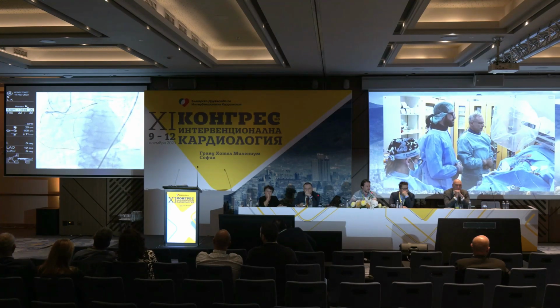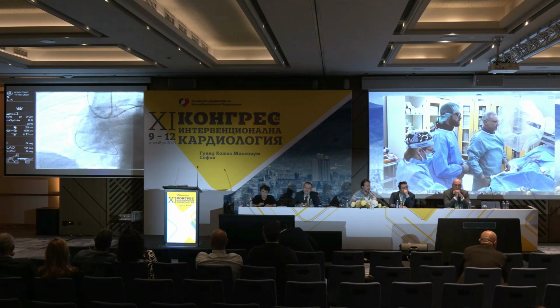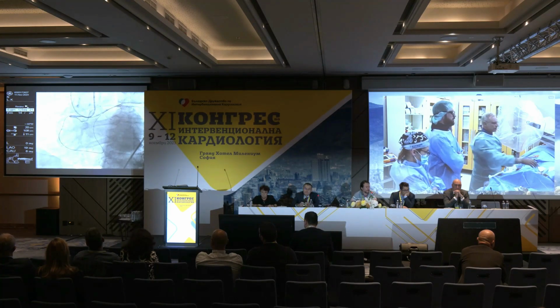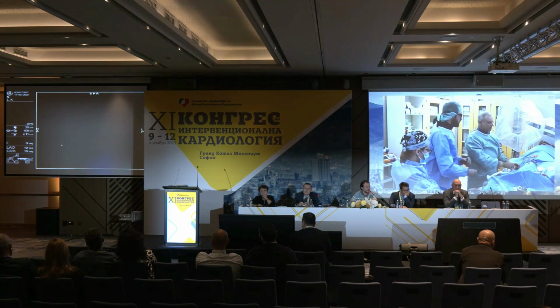So what you see here is that we are subintimal, but reasonably subintimal. With this wiring as I'm having it now, we clarified a little bit the vessel course. As you can appreciate here, we're not too wrong, and I'm pretty sure I confirmed that in 3 different projections. I'm going to show you. This was caudal. This is cranial.